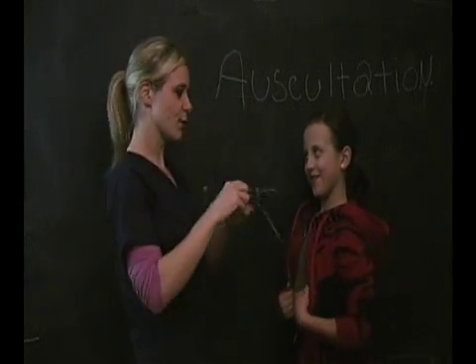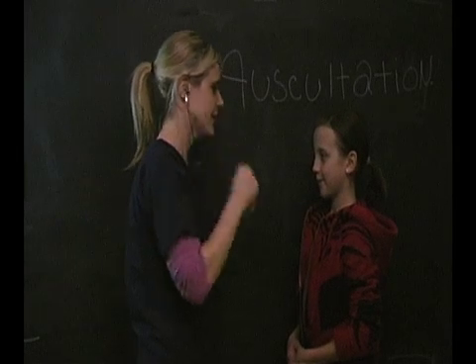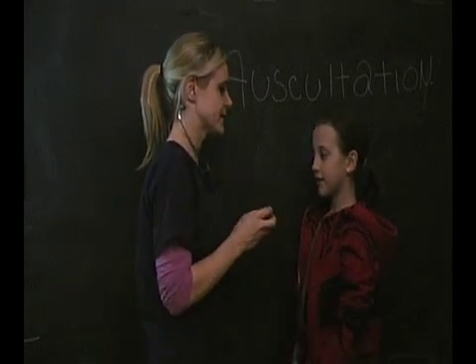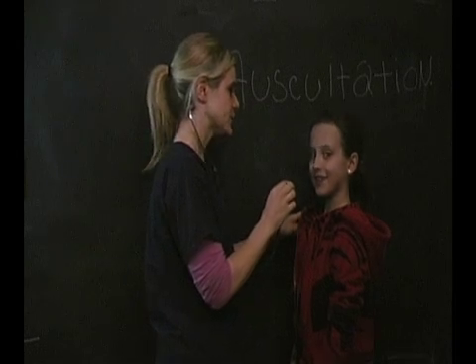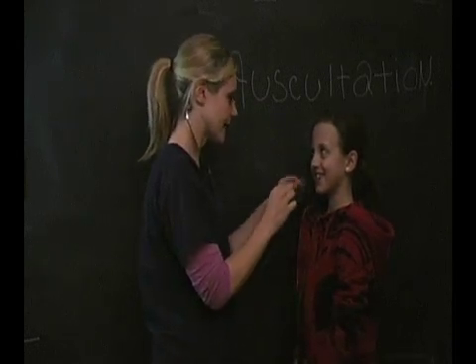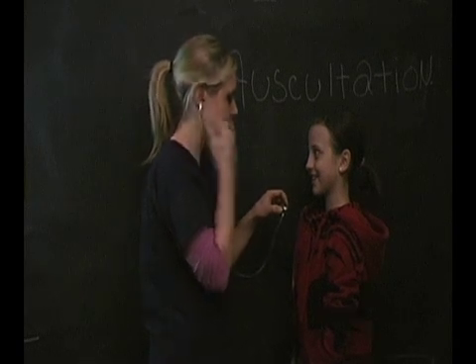Of course. Warm the stethoscope before placing it on the child, and try to avoid placing it over clothing or hair. Press firmly and try not to move your hand. Try not to have the child move while you're listening.